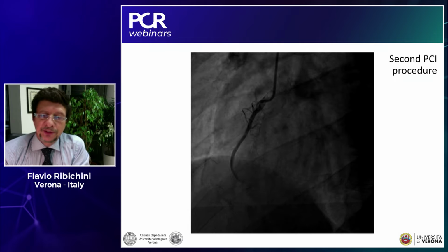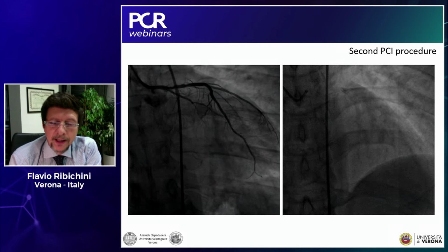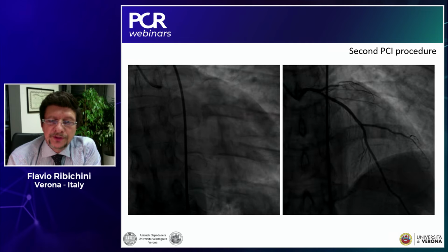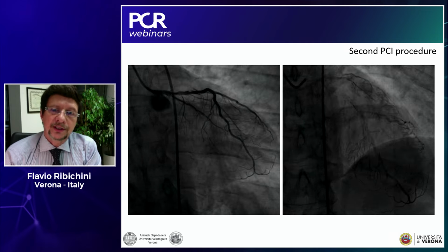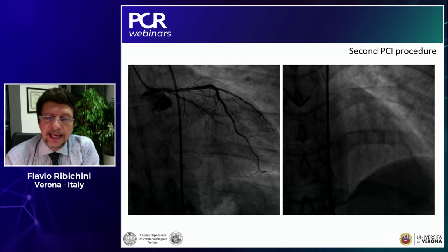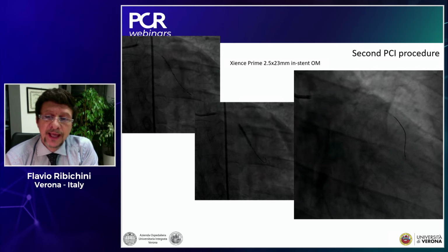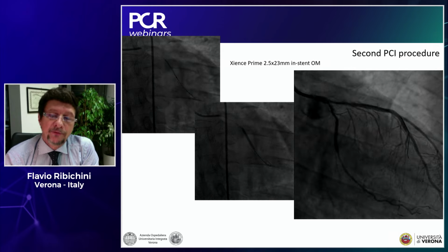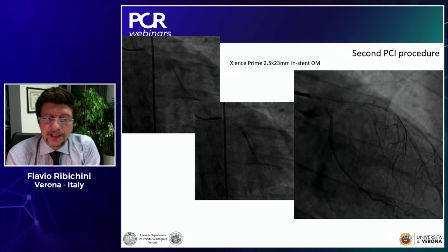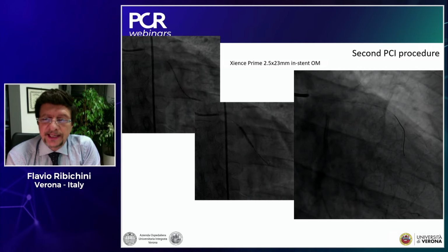But after only 6 months, he had stable angina again, so he came back for a second procedure. You can see the right coronary artery is dominant and normal, and here it is, a diffuse subocclusive restenosis of the small stent in the circumflex and a focal tight stenosis on the big LAD. Another operator took care of this patient. At this time, the everolimus eluting stent was in fashion, with the strongest evidence of safety and efficacy, and that was the choice at that time.